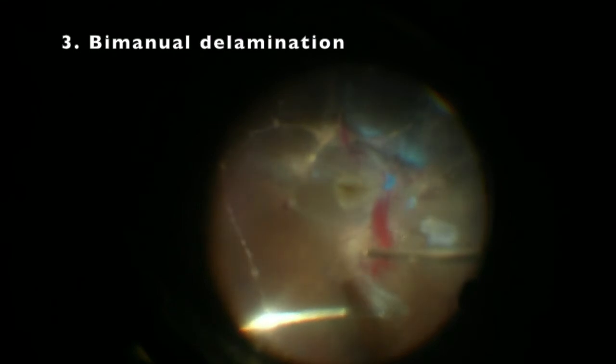Now the next one would be, if let's say the retina is highly detached and we could not induce a PVD using one single hand. Sometimes we have to do this manual technique of releasing the posterior hyaloid. So with the help of chandeliers, we have the chandelier on the other corner of the eye. We will use the forceps in one hand and a cutter in the other hand. Of course, the cutter will be facing away from the retina.